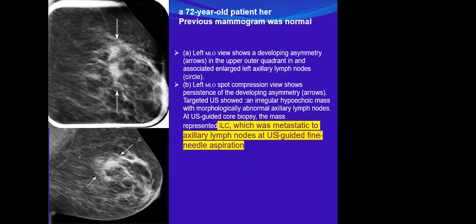The reaction of the normal tissue to the malignancy itself. Who is talking? I am Sarah Al-Makki. You're welcome, Sarah. Yes, the desmoplastic reaction, the fibrotic reaction, usually makes it fixed.